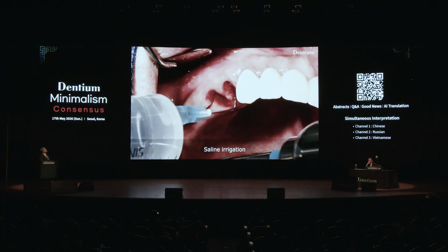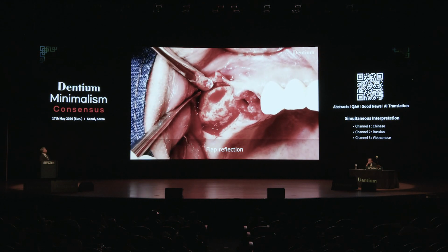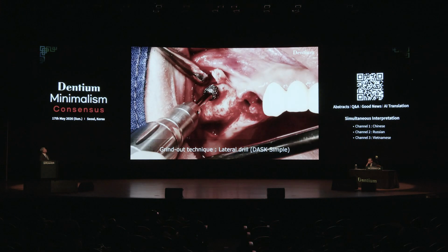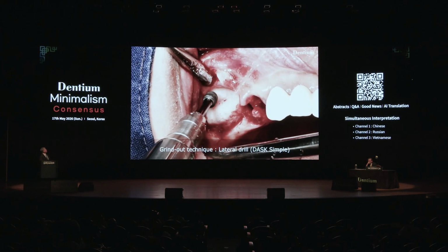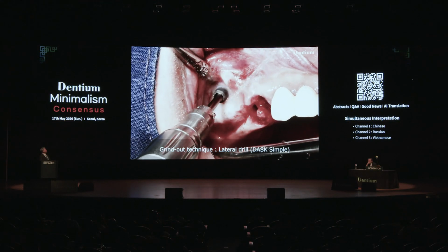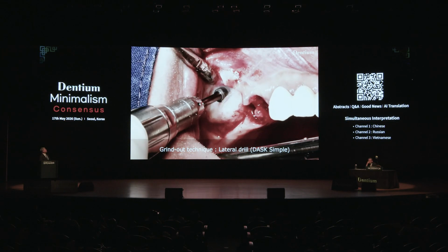Sometimes the extraction socket can be another source of infection, so we do a little bit aggressive irrigation to try to remove any pathogens. And also we use a little bit of a grinding-out approach technique, in the lateral side, with relatively high speed.